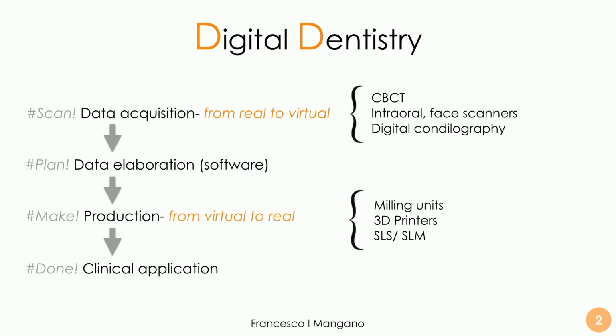Digital dentistry is based on 4 essential steps. The first step is the scan for data acquisition from real to virtual: CBCT, intraoral face scanner, digital condylography. Then we go into data elaboration through software for the planning phase, and after that we go back to real through the production of several things like surgical guides, crown bridges, orthodontic devices.